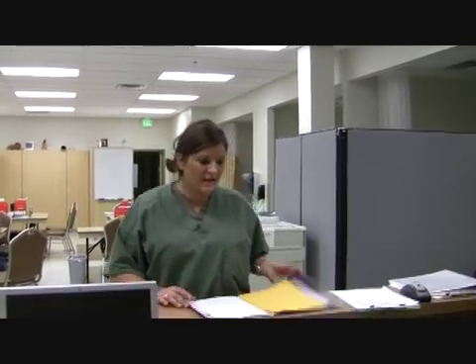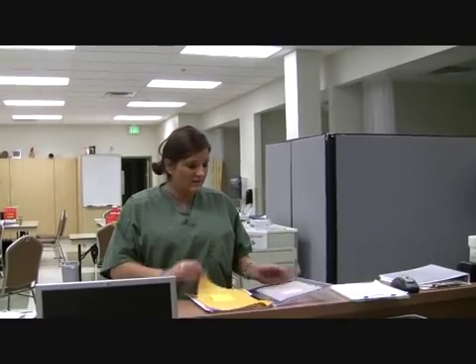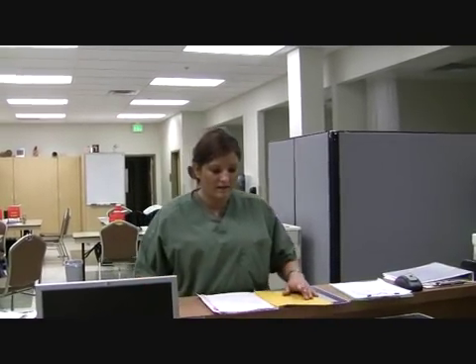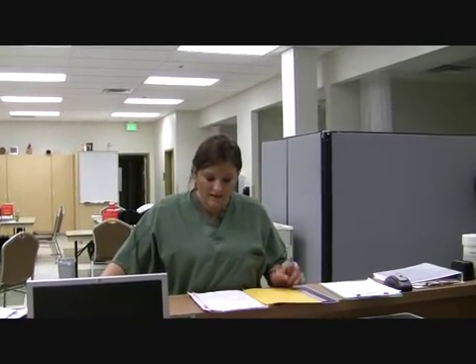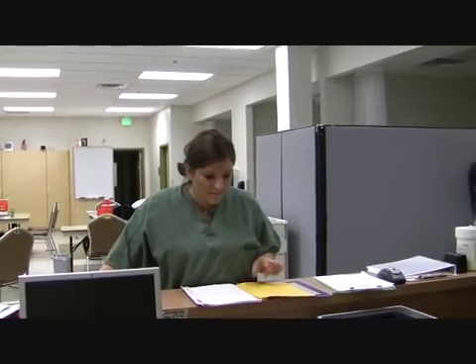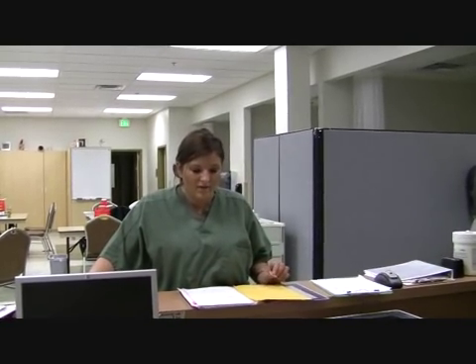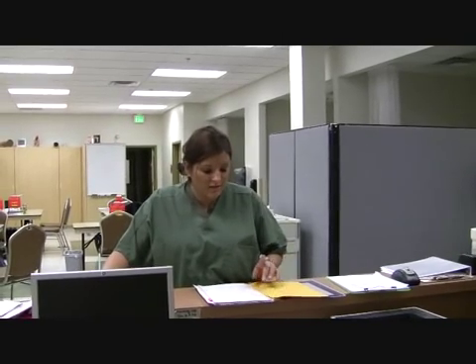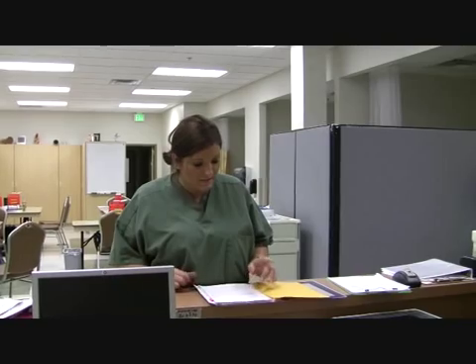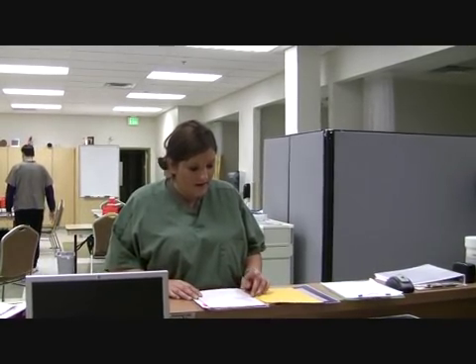Okay, so first we want to take the chart and open the chart and look at the order. We have Jane Jones. She's admitted for a motor vehicle accident, rule out ruptured spleen. Her birthday is 7/31/1955, medical record number 14573. She has an allergy to sulfa. Let's see, she's on bed rest, she's stable, nothing by mouth, vital signs every 2 hours.